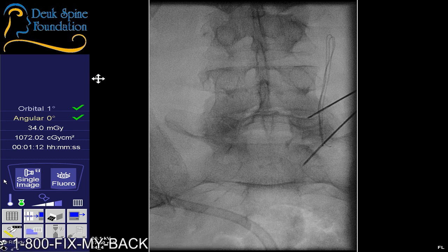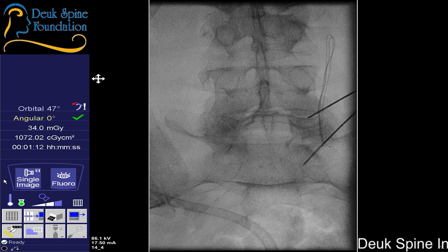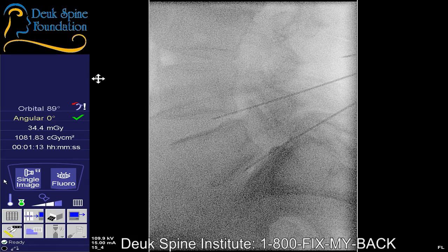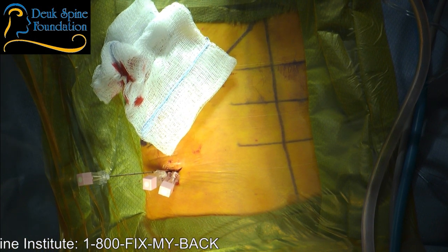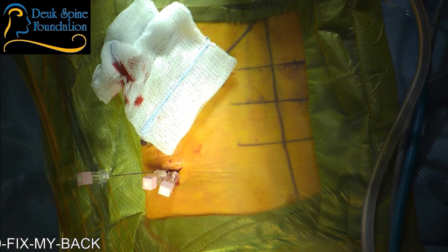All right. We're going to test those in just a minute. Let's get this last one in and see what it shows. Lateral. You doing okay so far? I need that L3-4 end plate lined up nicely. Yeah, that's much better. Thank you.